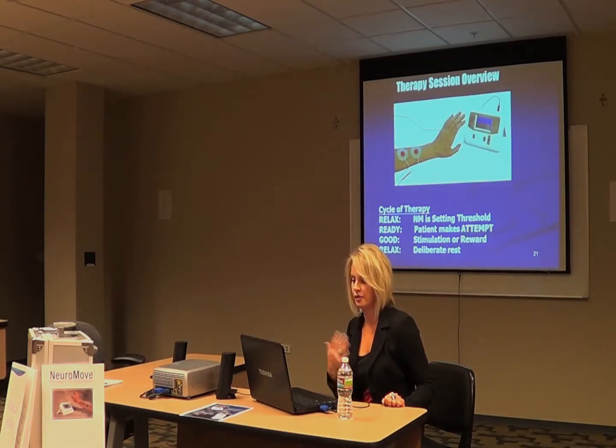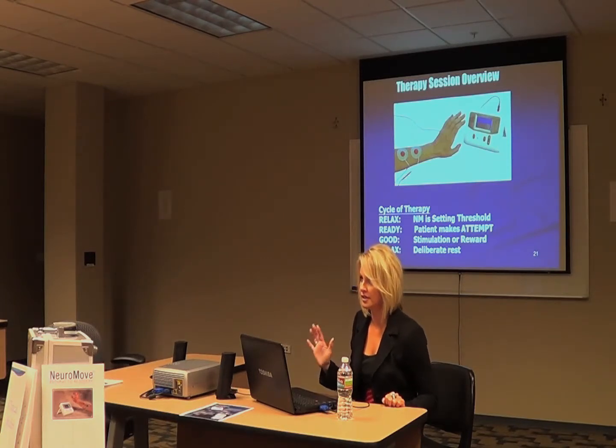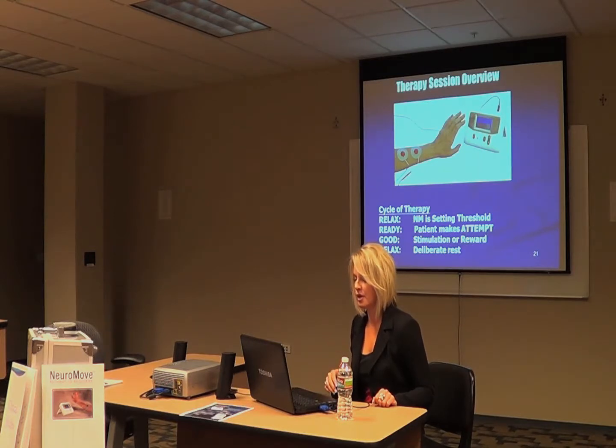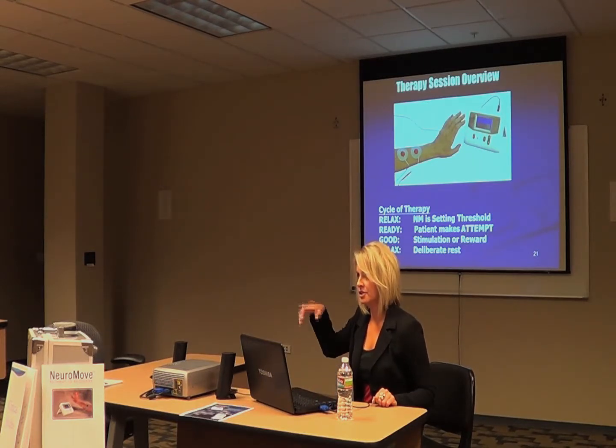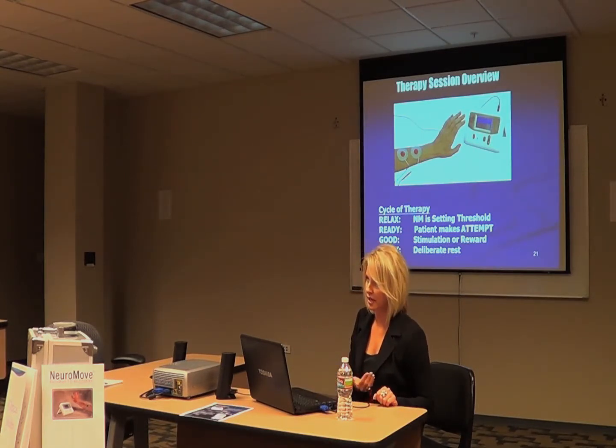Therapy session overview. Cycle of therapy is the very start of it. The NeuroMove is setting the threshold. I'll explain to you what that threshold is when we do hands-on. The ready, when the patient makes the attempt, when they're actually closing their eyes and really trying to visualize whatever it is that they want to do with their hand or foot or what have you. And then once they meet that threshold and it crosses, then they get that stimulation as a reward, and then it goes back to relax.